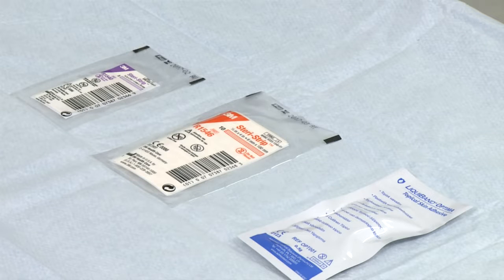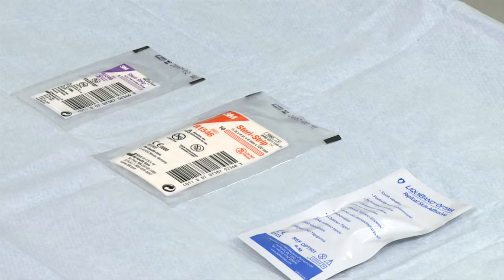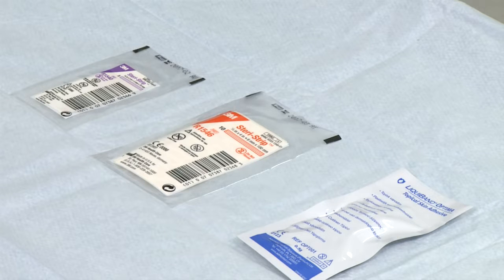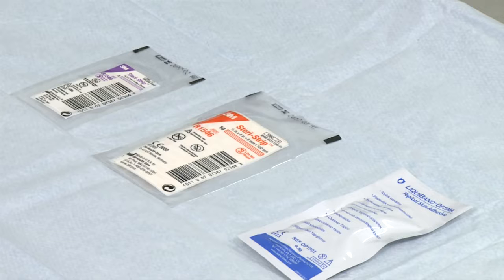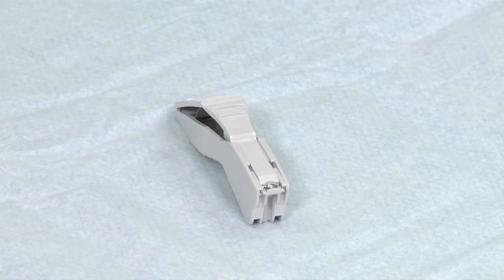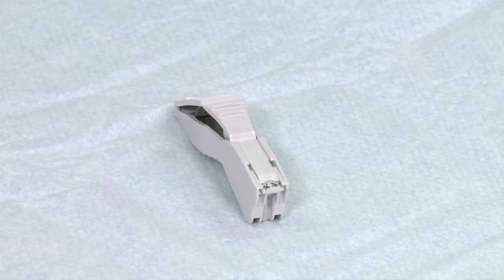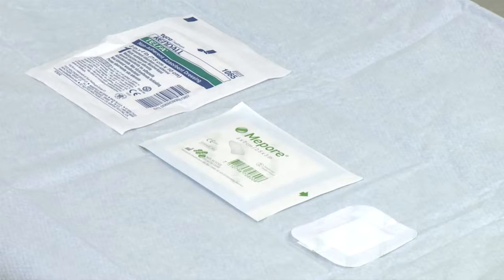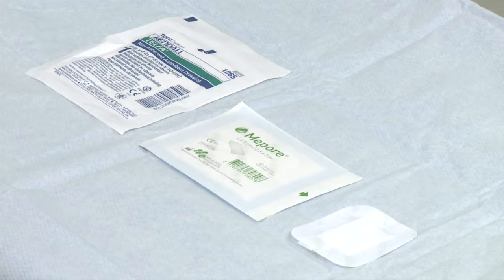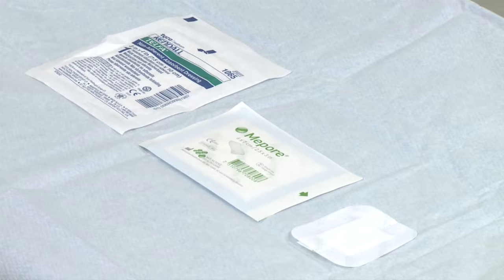Alternative closure methods include tissue glue or adhesive sterile strips. The glue is applied to the carefully opposed skin surfaces rather than the open wound. These methods are effective for simple wounds as long as good apposition of wound edges is achieved. Skin staples provide a fast method of closing linear wounds that do not need a perfect cosmetic result, for example scalp or limb wounds. If the wound is dry, a clear, vapour-permeable dressing allows inspection. If there is exudate, an absorbent yet non-adherent dressing should be used. Some wounds, for example those on the face, may not require dressing.